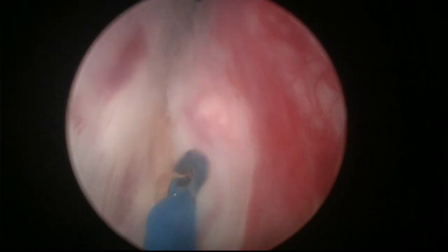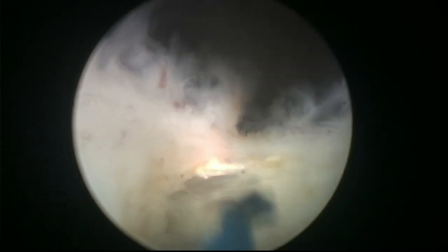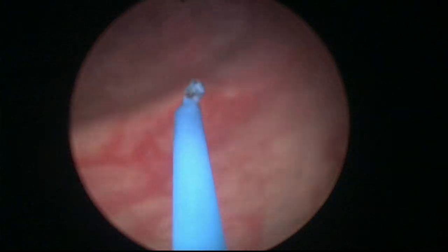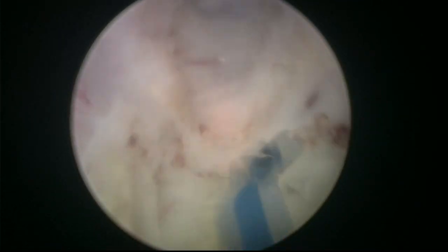Instead of going all the way down, I'm going to stay here. So this is the second incision — I'm coming towards the ureteral orifice, in the direction of the UO, and initially I'm doing the incision only in the proximal part, because this way I can simplify a little bit when I want to continue the incision.